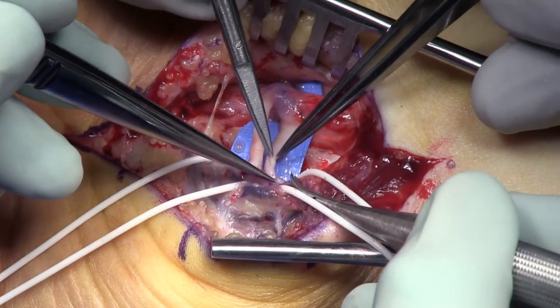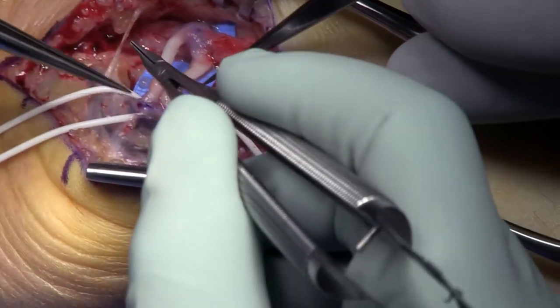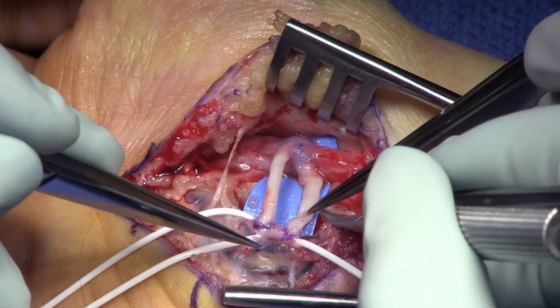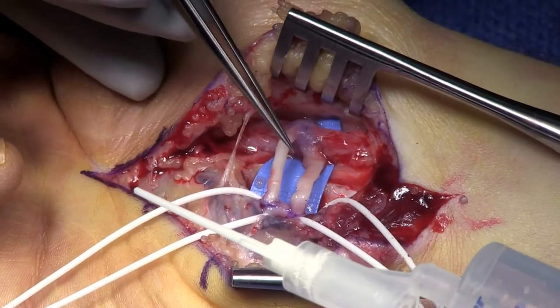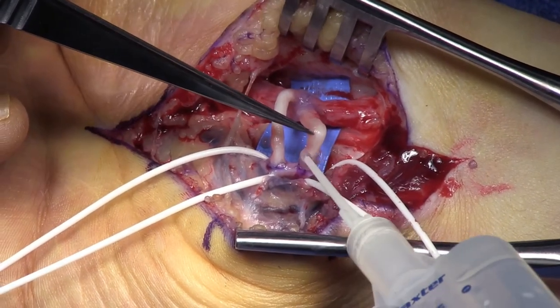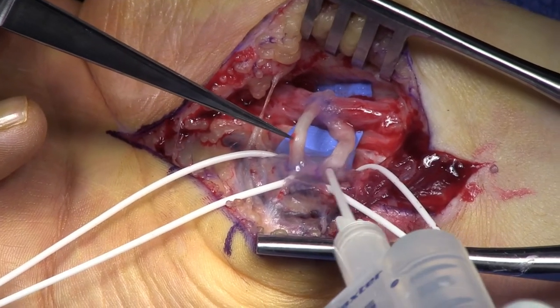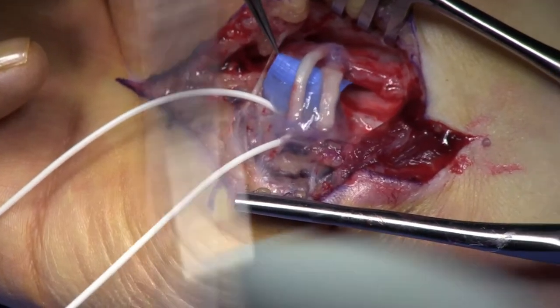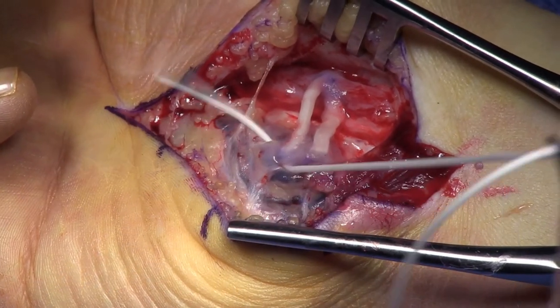In this patient, that ulnar nerve is normal. Now I'm holding the allograft up so it's going 90 degrees to the ulnar nerve, hold it in place with tissue sealant. The tourniquet will come down, good hemostasis will be obtained, and the incision will be closed after some Marcaine is placed in it.